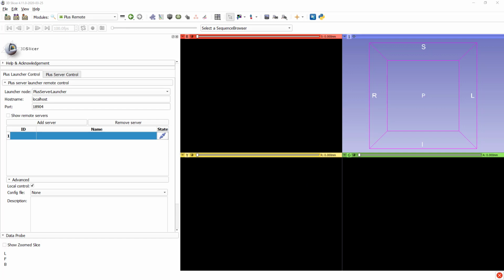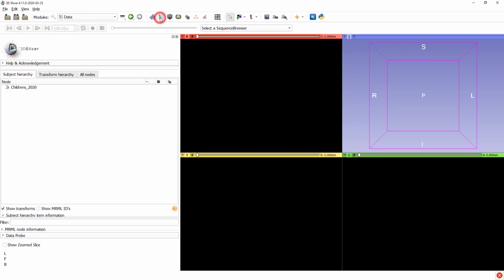And when it's loaded, it can be selected in the Plus server launcher to start a Plus server with this config file. We just press the connect button and we wait for the hardware to start up and the image and transformation nodes appear in the subject hierarchy.